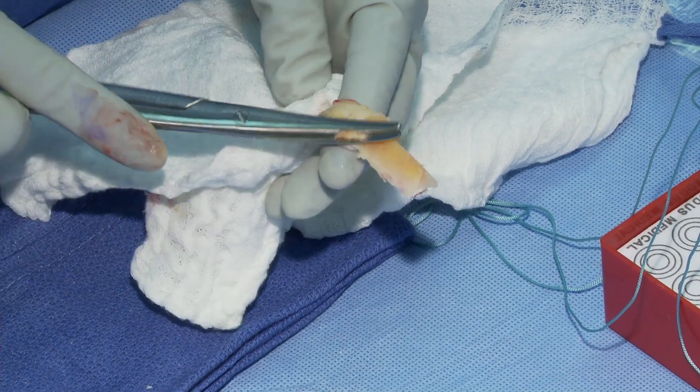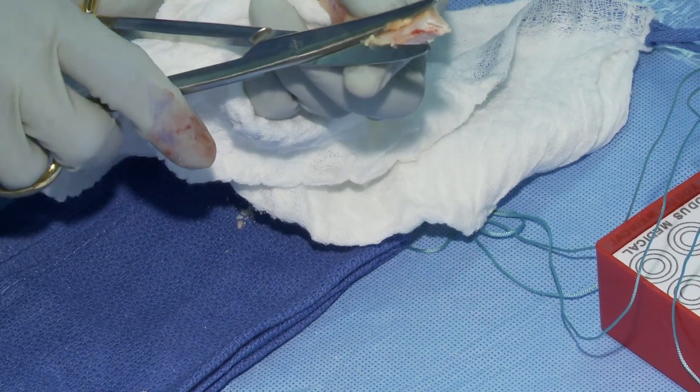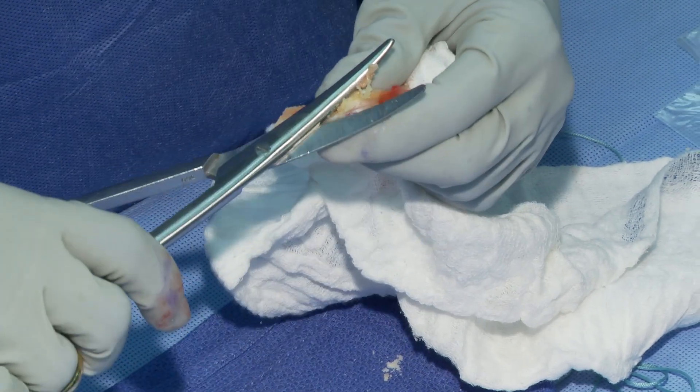Once the harvesting is complete, you move the graft to a separate table and that is where you prepare it.